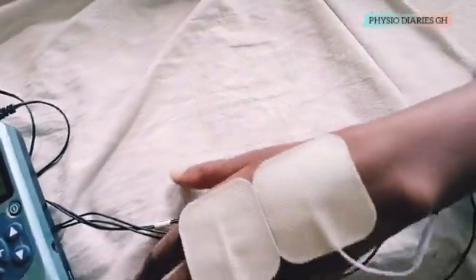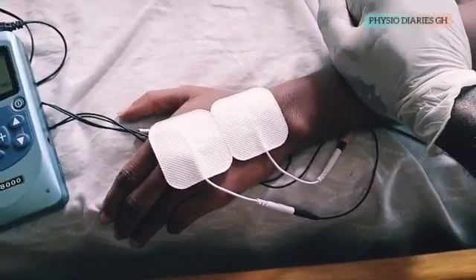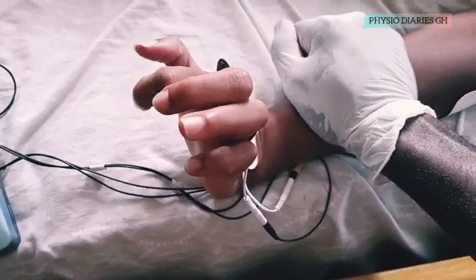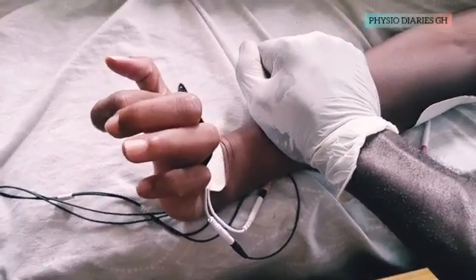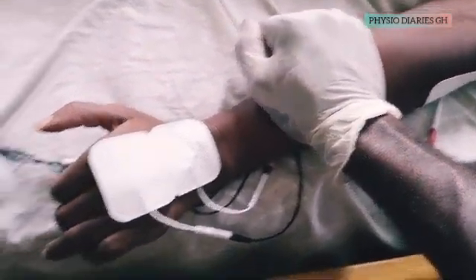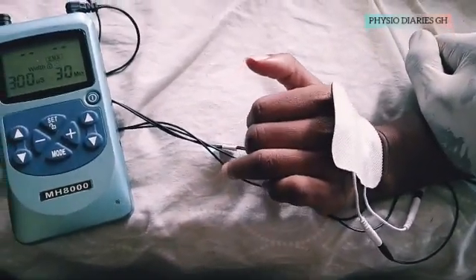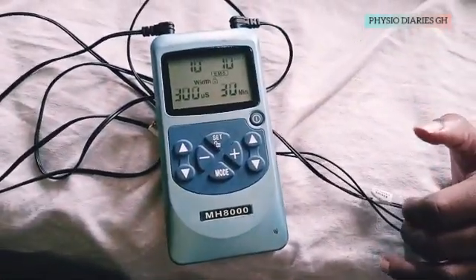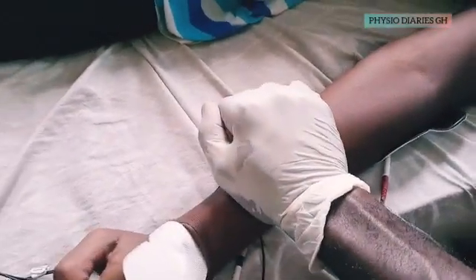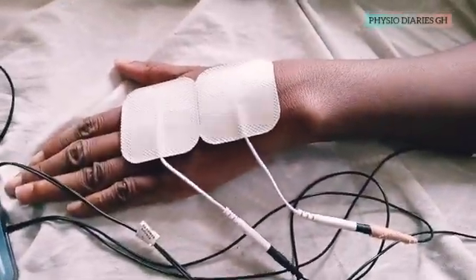In wrist drop, the patient is unable to perform active wrist extension. By using electrical stimulation, therapists can re-educate the lost function by stimulating the common wrist extensors for contraction, causing more visible wrist extension. In this video, you will be taken through electrode placements for wrist drop using a portable device with the EMS option.